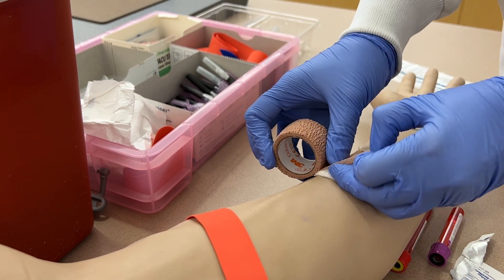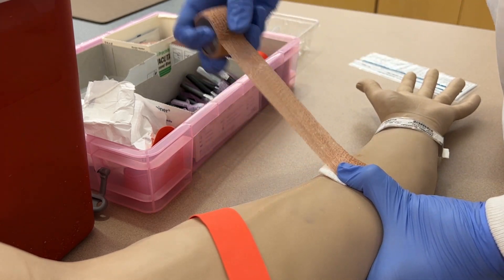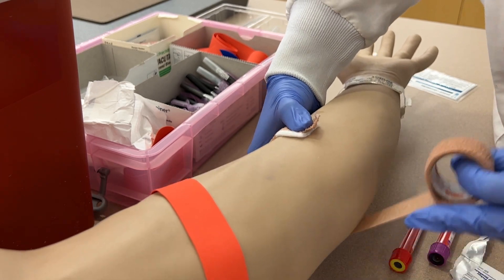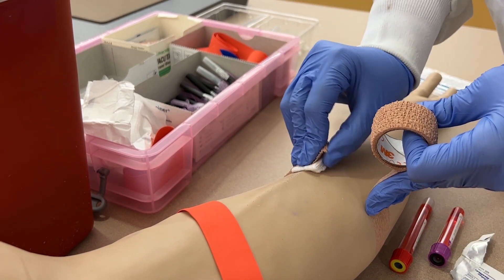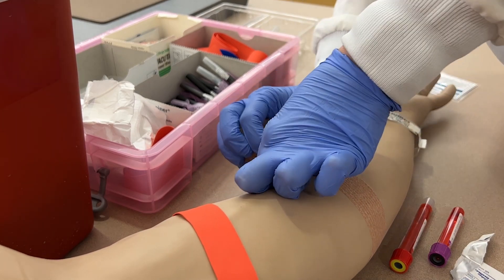You can use a band-aid to hold the gauze in place or coban as shown in the video. Counsel the patient that they should keep the bandage on for at least 15 minutes and avoid heavy lifting for an hour or two in order to avoid reopening the puncture site.